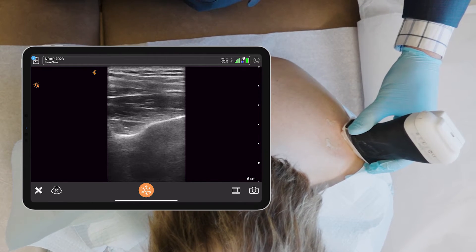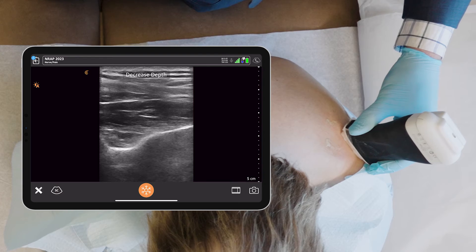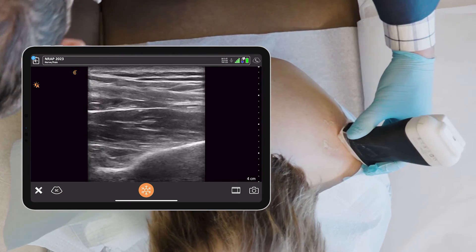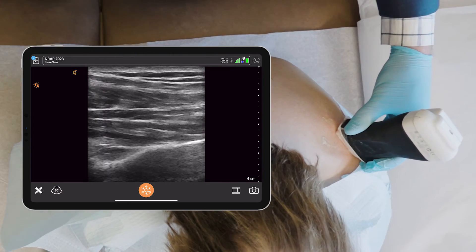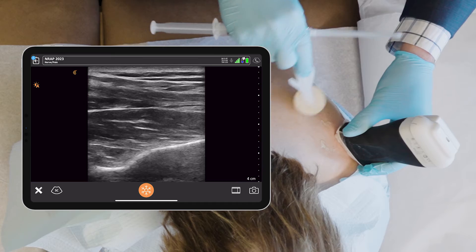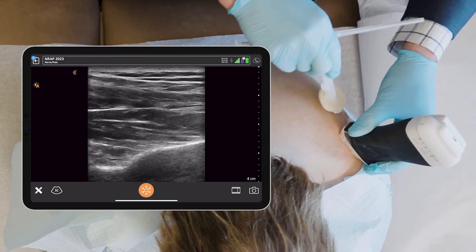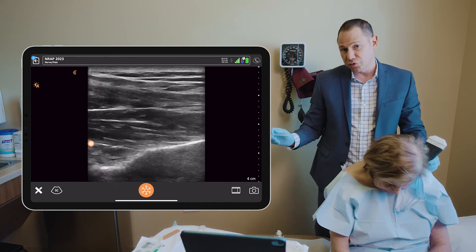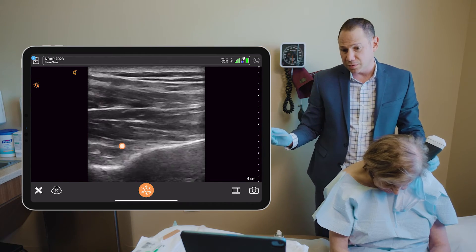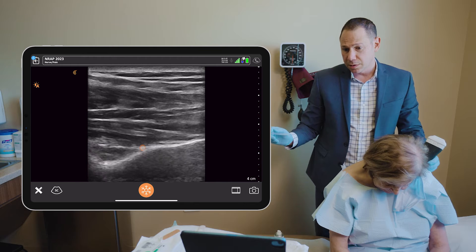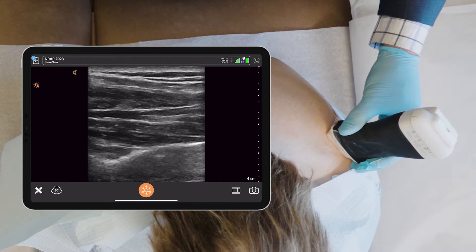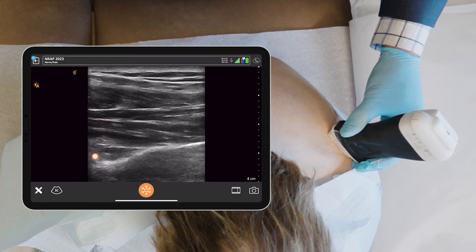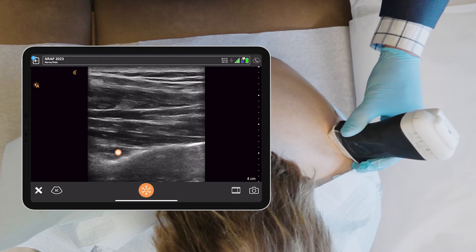Decrease depth. I found the suprascapular nerve on the transverse scapular ligament. Underneath that is the supraspinatus muscle, and the nerve is at the bottom of the screen.